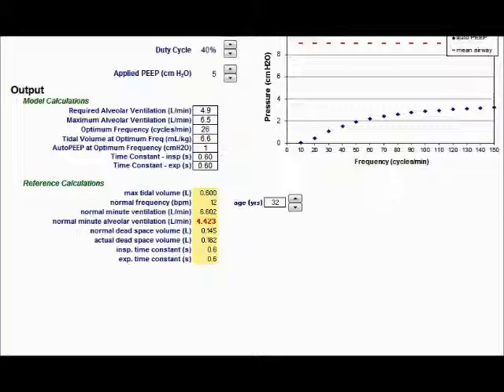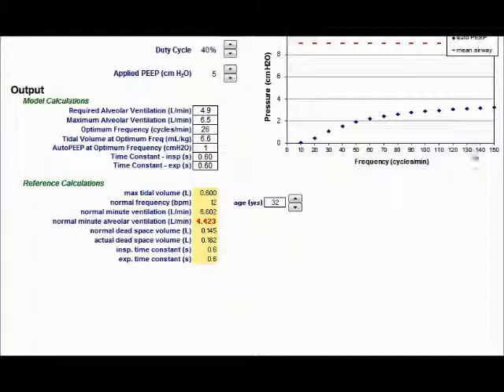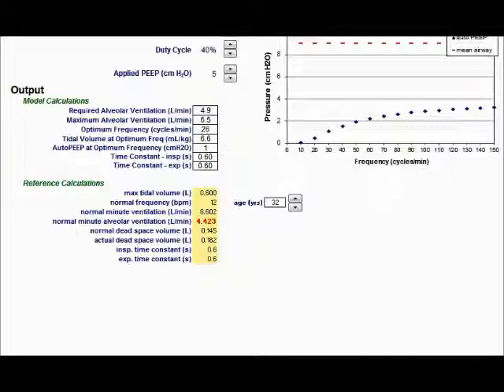That's the max tidal volume obtainable. There are other factors like resistance, your respiratory rate, and your I-time that might affect this max tidal volume delivery. Now let's look at this with the ventilator simulator also.